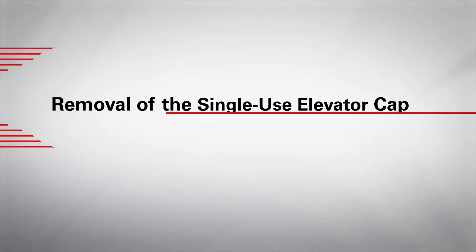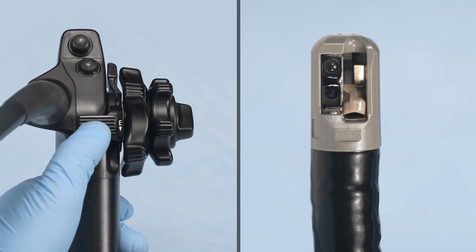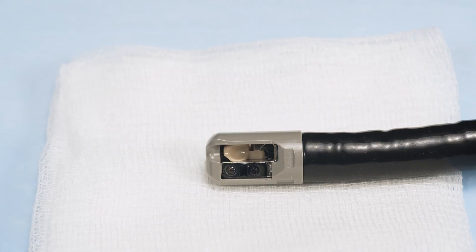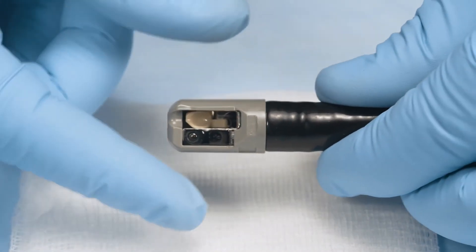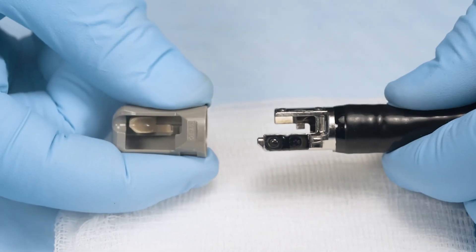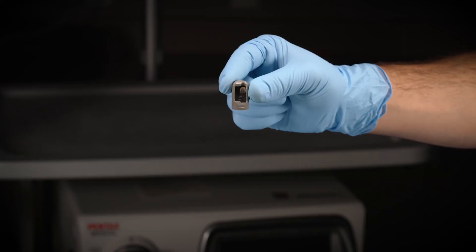Complete the following steps to properly remove the single-use elevator cap from the DEC-HD duodenoscope. Ensure the elevator is in the disengaged or lowered position — move the elevator control lever proximally until it stops. Gently grip the end of the bending section of the endoscope with one gloved hand, and with your other gloved hand, gently hold the proximal side of the single-use distal end cap. Slowly pull the single-use distal end cap straight out to remove it. Visually inspect to ensure no parts are remaining on the distal end of the endoscope, then throw away the used elevator cap.